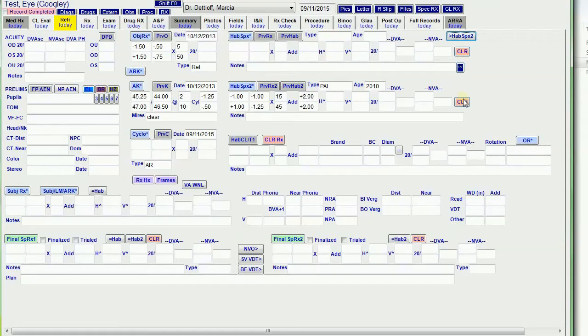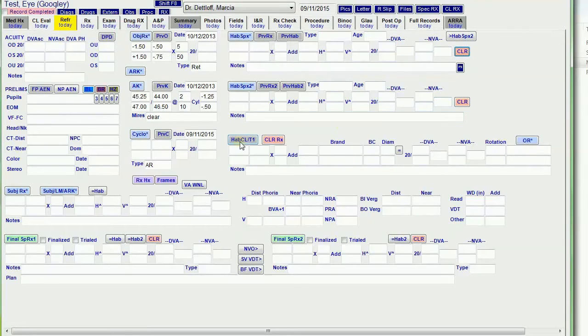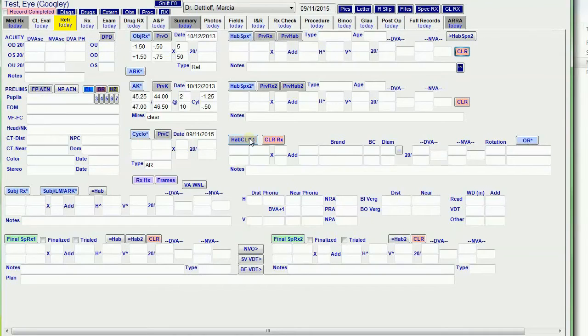These clear buttons clear out the information for either one of the prescriptions. I've also got the habitual contact lens information on this page, so on this page I can do the preliminaries. We can check their vision and check contact lenses.